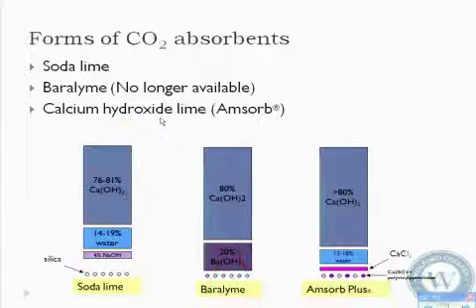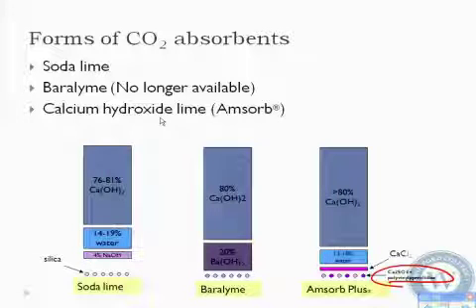And if you see a hardener, that helps that pellet not turn into dust. That's why they put these hardeners in here. You'll see that throughout your reading and as you study for the C exam and boards, you're going to see silicas or calcium sulfate placed in. These are simply hardeners to ensure that the pellets don't turn to dust, because that dust is toxic. The patients can't breathe that dust. If they do, you're going to get laryngospasms, bronchospasms, and all kinds of bad juju. So you have to try to prevent it.